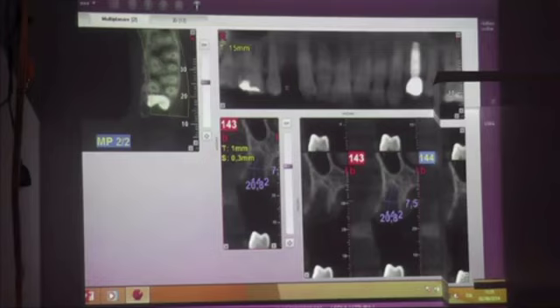Soon, very soon, in the future. This instrument for us, because if you have this instrument to work in implantology, it's easier. Maybe after September, October, we will all have this or another seat, but I think we put one of these X-ray units where it's very easy to read the imaging.